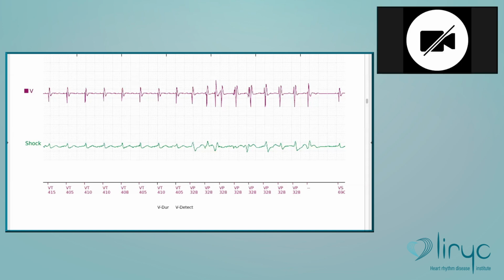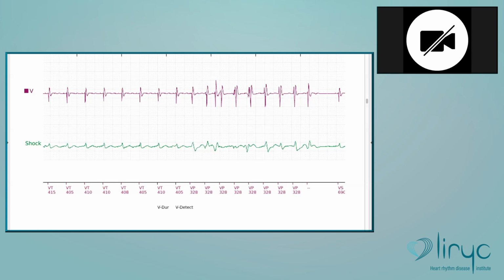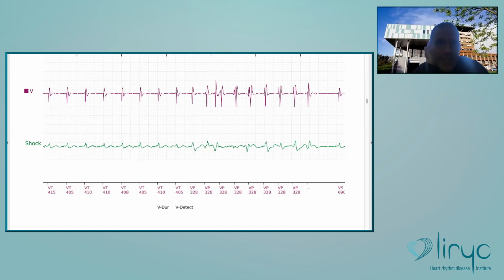Is this the same for all criteria for the discrimination? It's the same for sudden onset and stability for a single chamber device. You will see when we study the dual chamber discrimination that there are many other parameters, like stability, V faster than A, and atrial fibrillation.